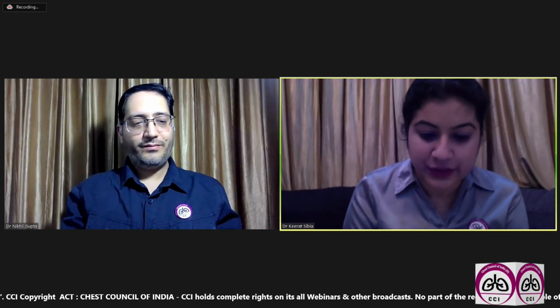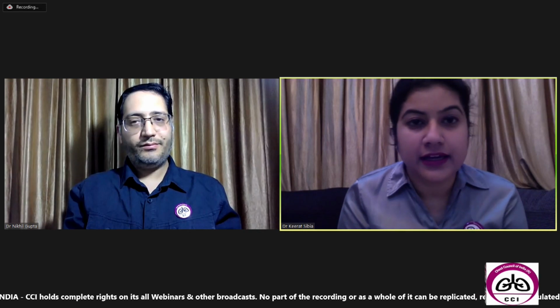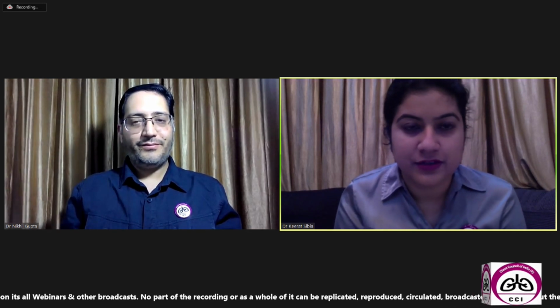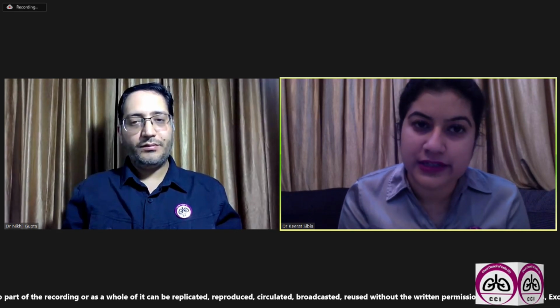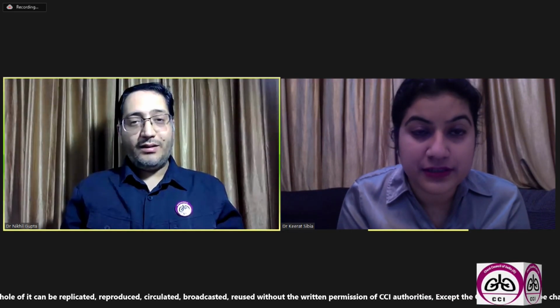The next thing I would like to ask you is, we commonly read in chest X-ray reports, and also use the terms, that there's a consolidation, or there's a collapse, or there's a collapse consolidation. I want you to particularly talk about these terms: when to use the term consolidation, when to use the term collapse, and when could we use collapse consolidation?